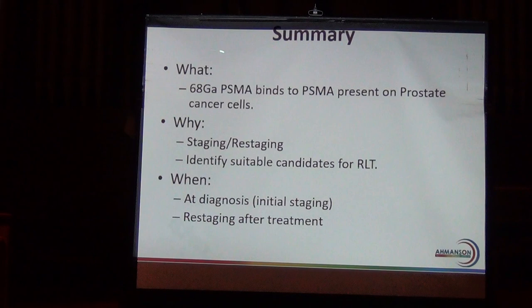Okay, so what is imaging? The gallium-68 PSMA binds to the PSMA target that's present on prostate cancer cells. So why do we do imaging? We want to stage and restage the disease depending on where you are in the treatment trajectory. And then, although this is currently only available as research, at least in the United States, once this becomes FDA approved, hopefully in the future, the imaging helps us identify candidates that would be able to receive a radioligand therapy.